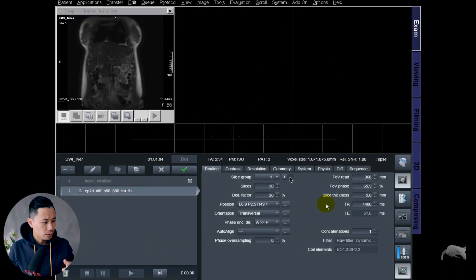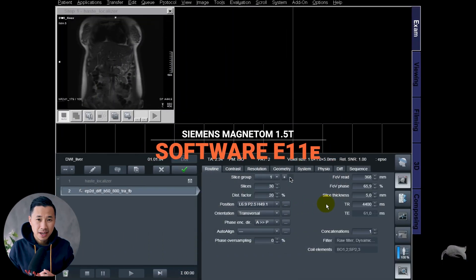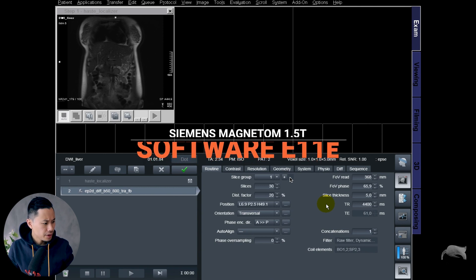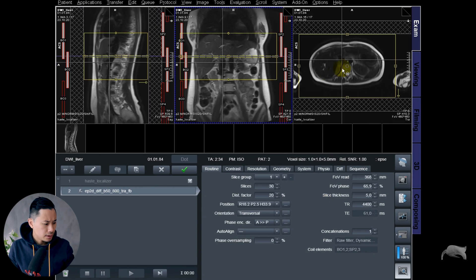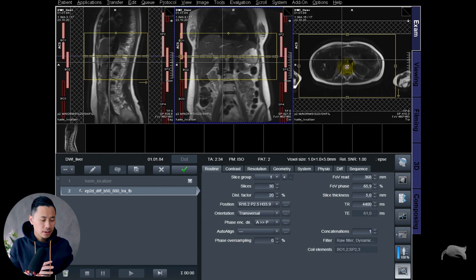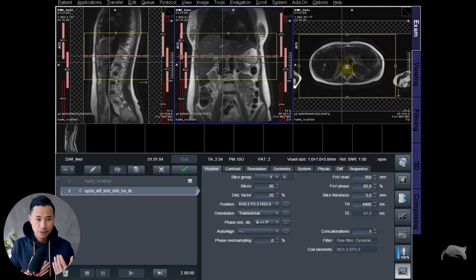Alright, currently we are at 1.5T lab, but this doesn't matter — you can do this as well on 3T. So in front of you here, you have live imaging and we have a localizer right here. Let's run that one. I'm going to do two scans: one with the artifact and one without the artifact, so you can see the differences.